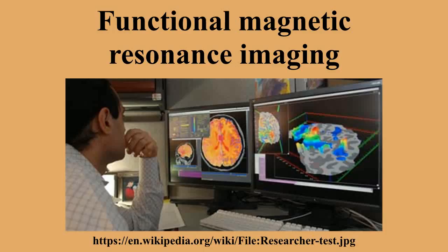When the RF field is removed, the nuclei go back to their original states, and the energy they emit is measured with a coil to recreate the positions of the nuclei. MRI thus provides a static structural view of brain matter. The central thrust behind fMRI was to extend MRI to capture functional changes in the brain caused by neuronal activity. Differences in magnetic properties between arterial and venous blood provided this link.